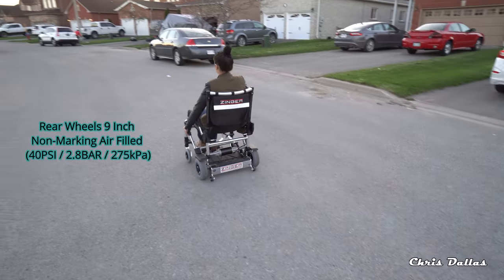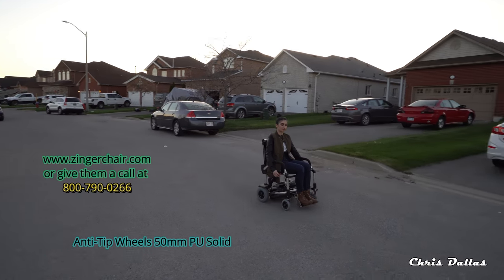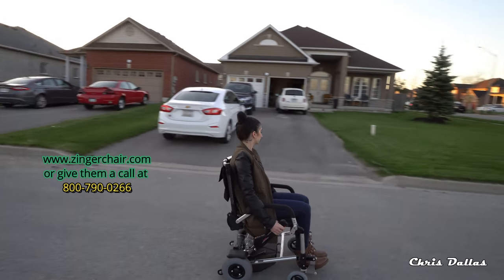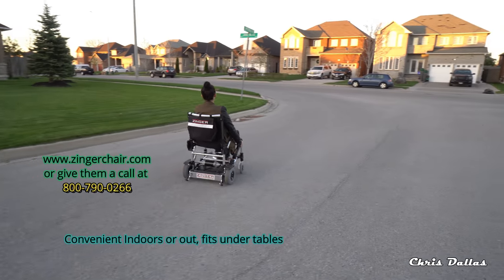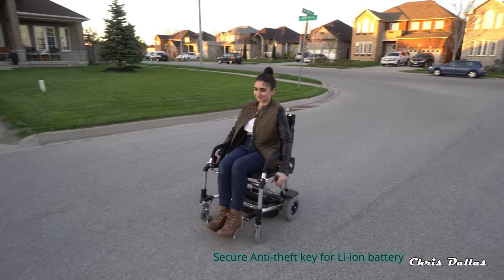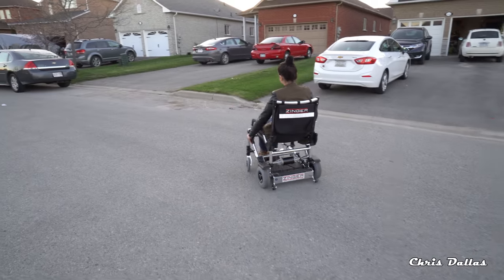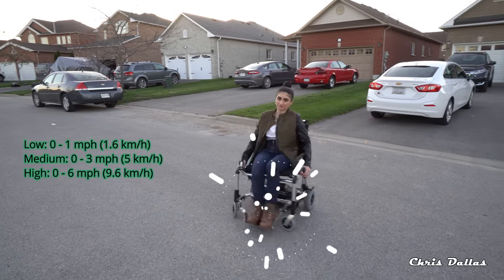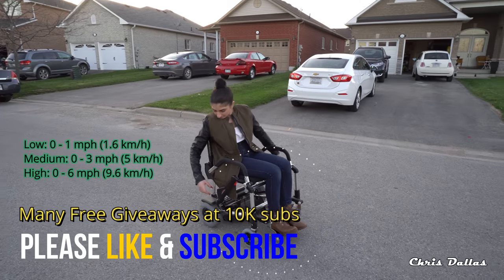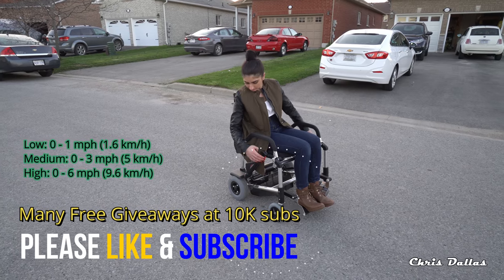It takes about a minute as a learning curve — about a minute. Once you learn how to use this, it's really, really simple. You don't really care for one of those other chairs. The first speed is up to 1.8 kilometers an hour — or it could be miles, I'm not sure. I have a video explaining the different speeds.